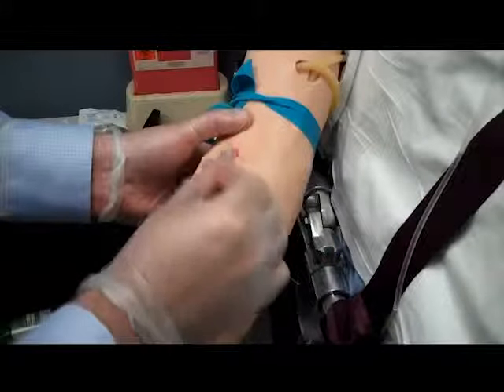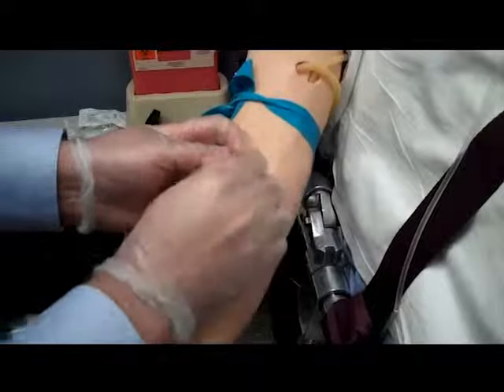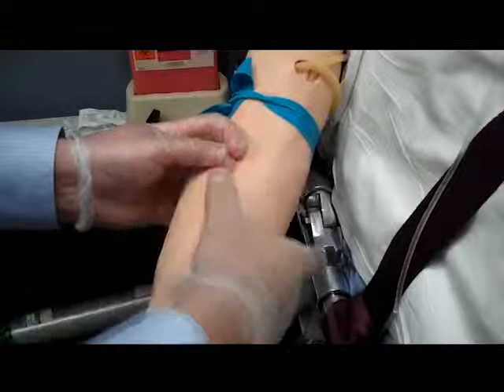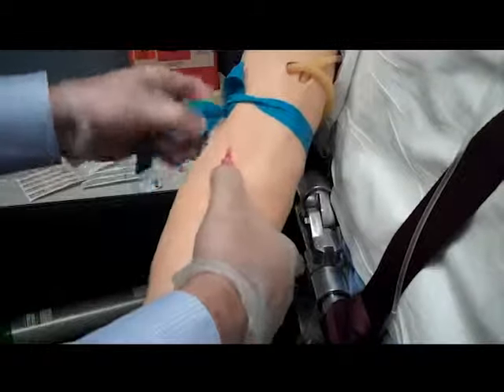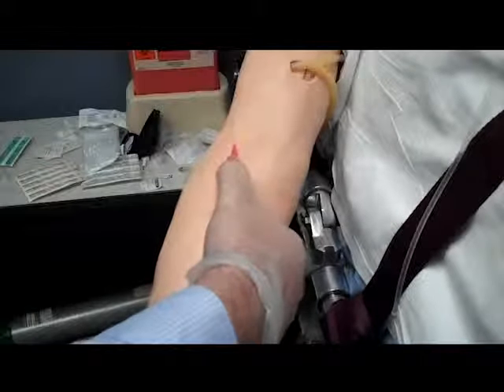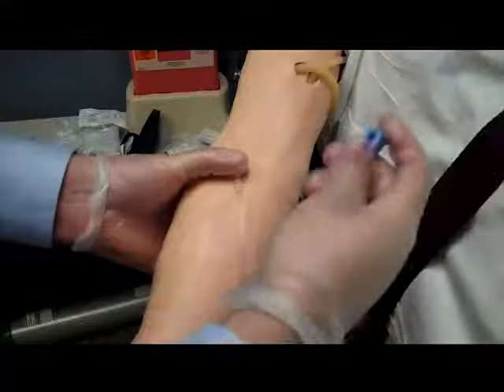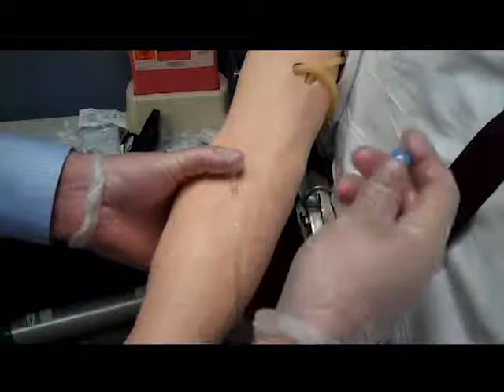Remove the cap from the end of the IV tubing, being sure not to contaminate the end. Attach the end of the tubing to the catheter hub. We can now remove the constricting band. When you have the IV tubing securely attached to the catheter, you can then open the flow valve to allow fluid to run for a few seconds. This ensures you have a patent IV site with no signs of infiltration, inflammation, or occlusion.